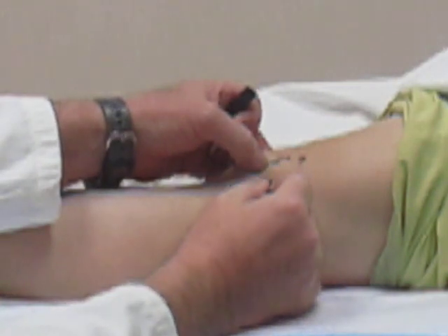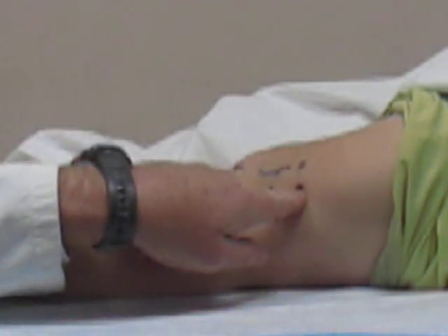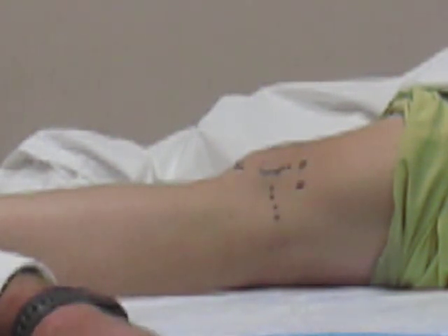I also like to identify the joint line as well. The third thing I'll do is anesthetize this supralateral arthroscopy portal region with either marcaine or lidocaine. Before you do that, make sure you identify if the patient has any allergies to those medications. Anesthetizing that area will help improve patient comfort and compliance and make it an overall better procedure for the patient.